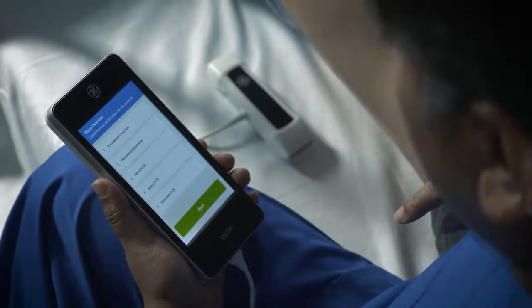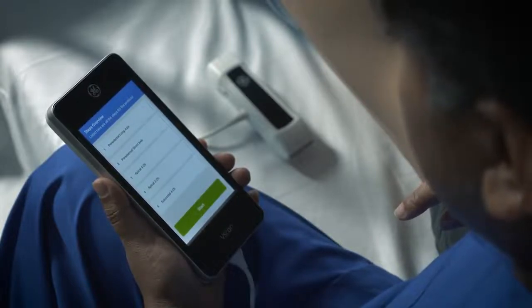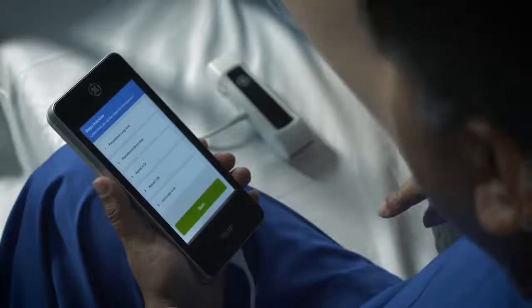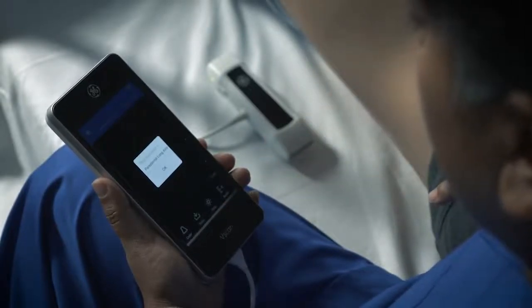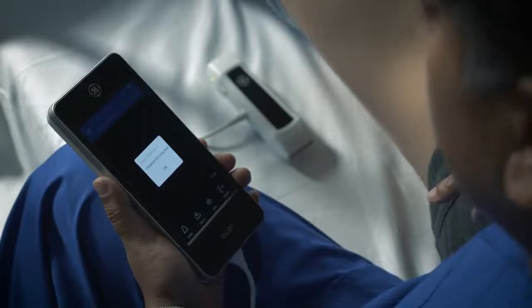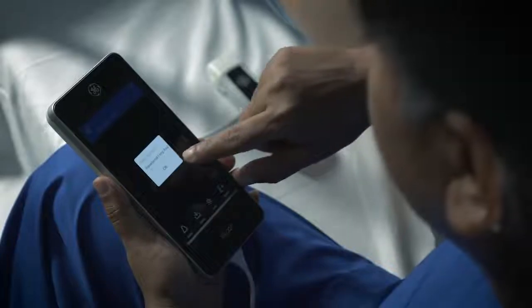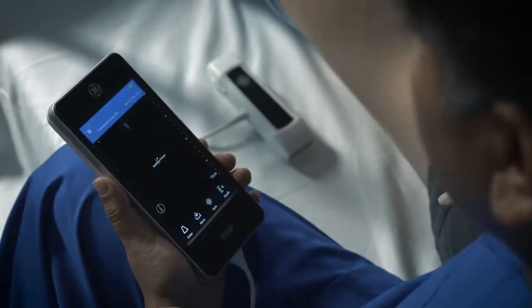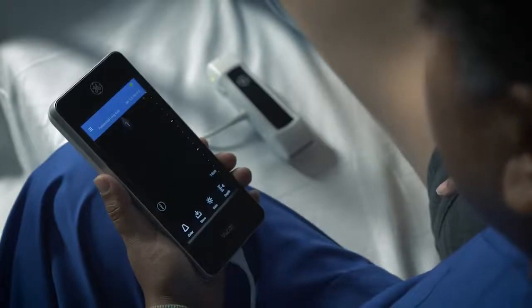At the Steps Overview screen, the steps for the protocol are displayed. Press Start to begin at the first step. Note that you will have the ability to start at any of the steps you choose. You will see the user instructions for step number 1. Press OK. Note that the default preset for the protocol is loaded automatically.